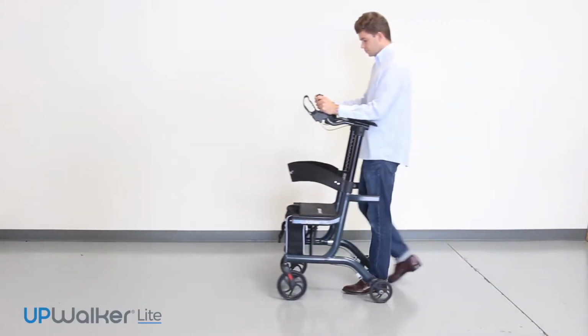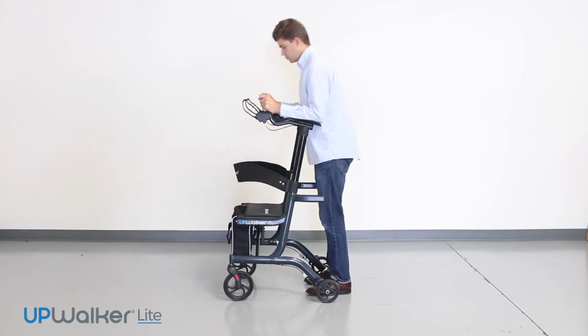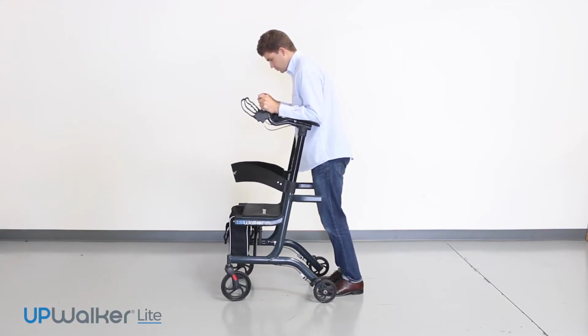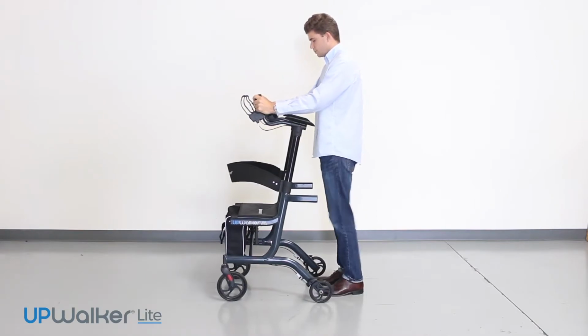and taking your other hand to push the brake handle forward until you hear a clicking, which acknowledges the locked position of your parking brake. Once both parking brakes are on, you may sit down in the unit.